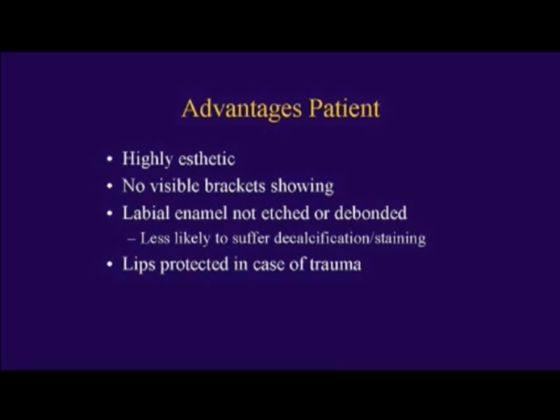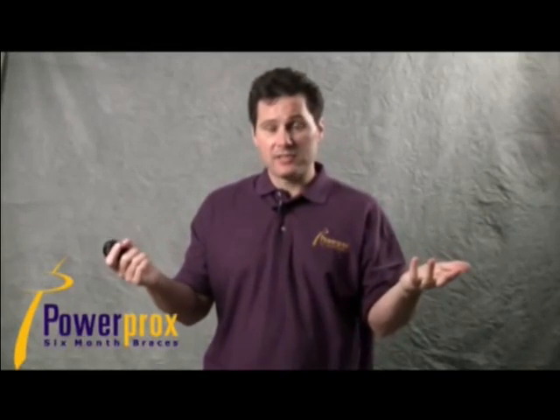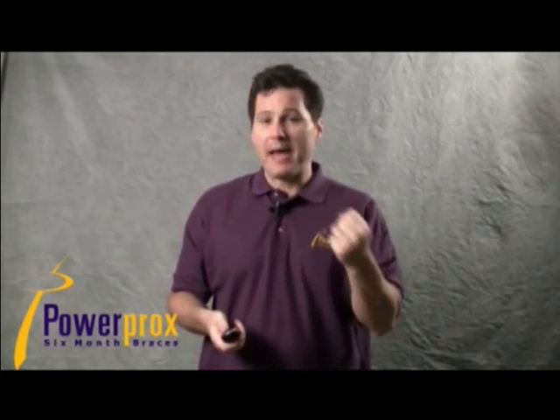And also, if they happen to be active in sports, if they catch a ball to the face, you're not going to be peeling the lip off of labial brackets. We've all, I'm sure, had that situation, unfortunately. If it hits them in the face and they have lingual braces, it's going to protect their lips in case of that impact or that trauma.